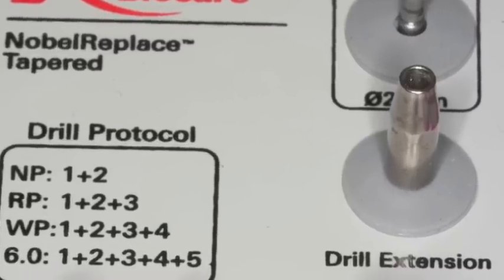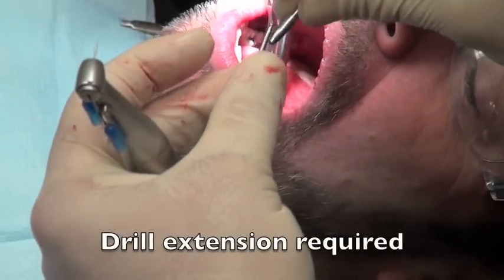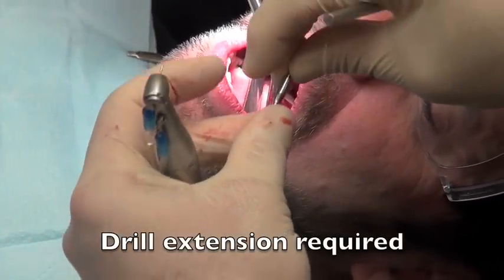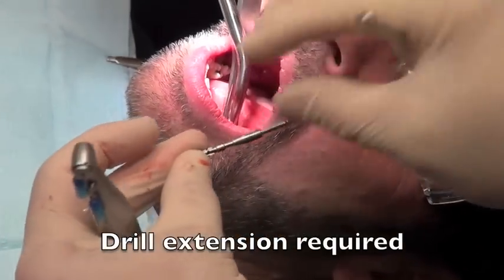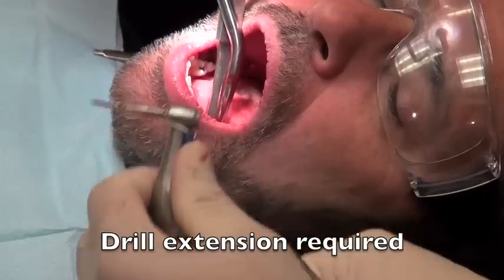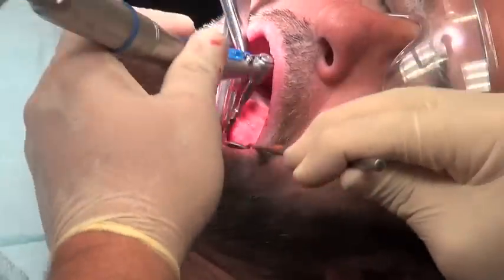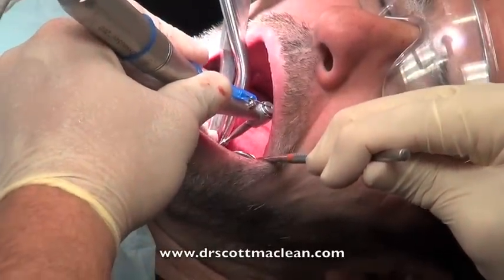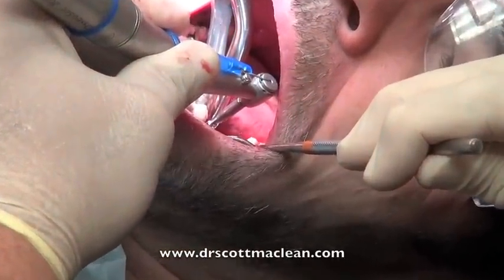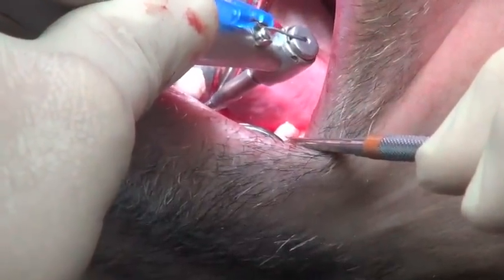Water is going to be coming out of the drill. Then we're going to use a drill extension because we're bumping into the adjacent tooth, so we can make this a little bit longer. Adding the extension allows me to bypass hitting the tooth right next to the area. You have to have the patient open wide to get this in their mouth. So we just penetrate and keep going down until the mark on the drill is at the top of the ridge or wherever you're referencing.